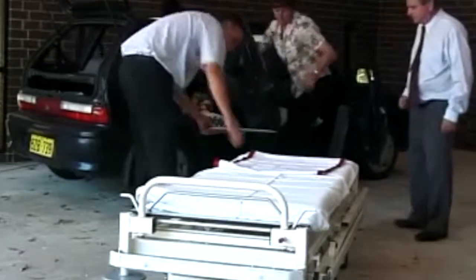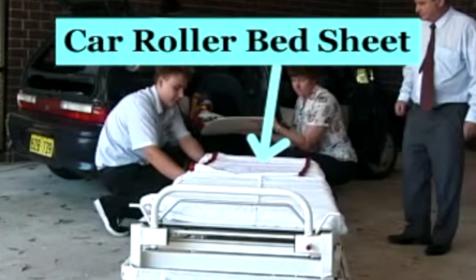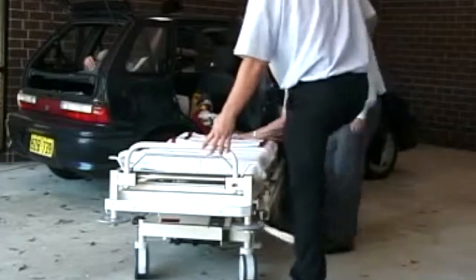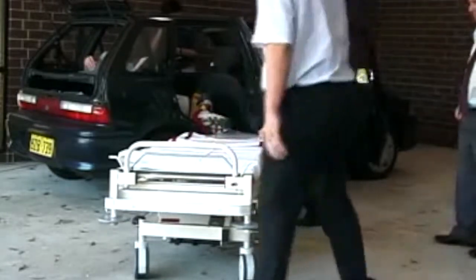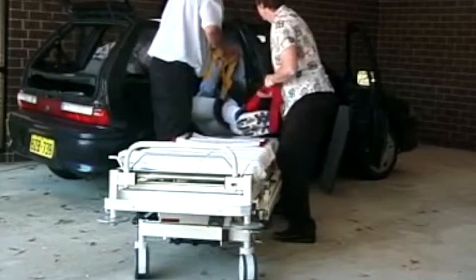The person inside the car is in charge of the patient's evacuation, saying when to pull and when to stop. A car roller sheet or a bed slide sheet can be placed on the trolley to help slide the patient into position once they are on the trolley. The trolley's brakes should always be applied to stop the trolley moving when evacuating a patient. The two carers outside the vehicle will control the thigh and ankle straps and pull the patient out along the board onto the trolley. Note that the outer edge of the slide board is being held here as the patient is moved around to be evacuated from the car.